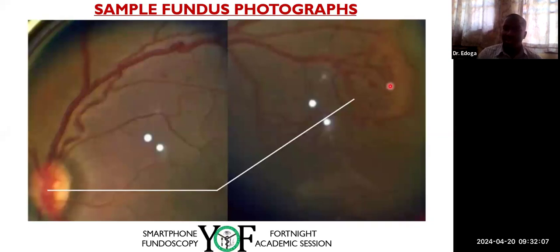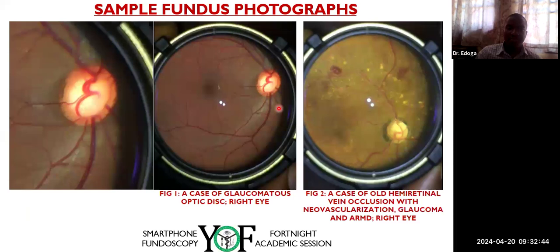And you can see the tufts here. You can see that they already entered into zone 2. And you can see evidence of tortuosity of the vessels. You're already thinking of a plus disease. So this is a typical image that you're going to get if you master the technique with a smartphone, and you can use it for documentation also. And for interpretation, if you are in doubt and don't know which treatment to give this patient, you can actually transmit this to a pediatric ophthalmologist for consultation.